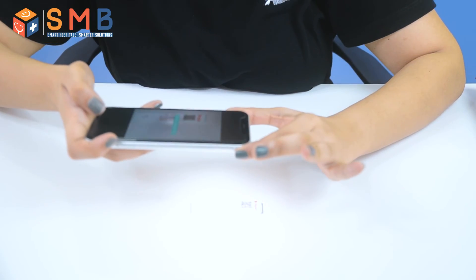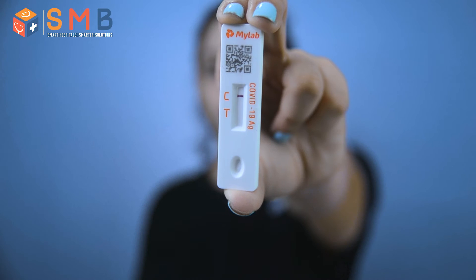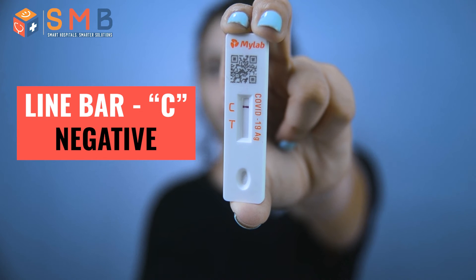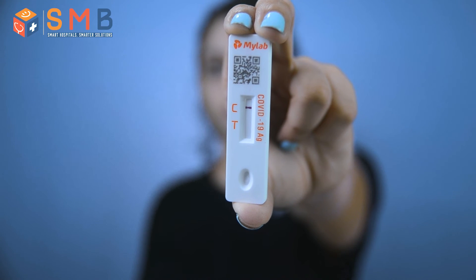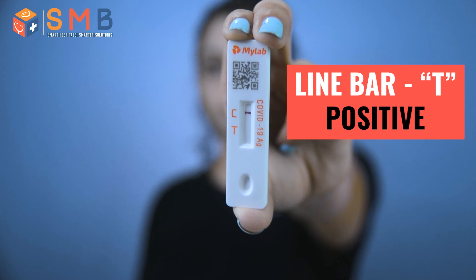A few moments later. So I have got an alert to check the report. To check the report, you again have to take a photo of the test card. Your test result is negative. The line at C indicates negative — that means COVID-19 antigen is not present. A line at T indicates positive, meaning COVID-19 antigen is present.